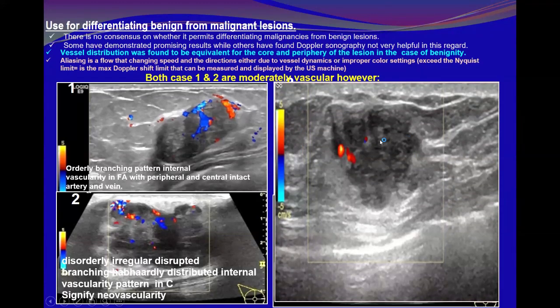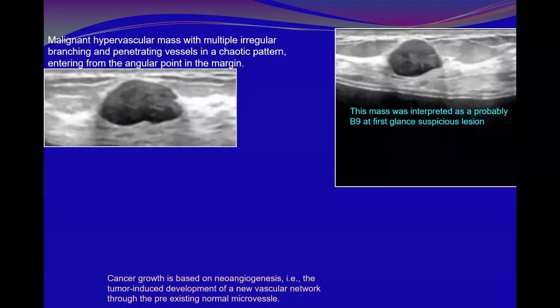This is my patient also. Look at the vessels here. Compare it with this. It seemed to be a complete vessel, but look at these feeding vessels here. Even in all directions, it looks the same, not like this one, intact, simulating native vasculature.